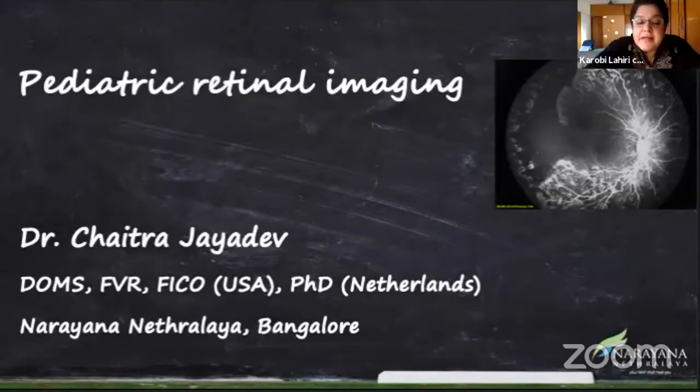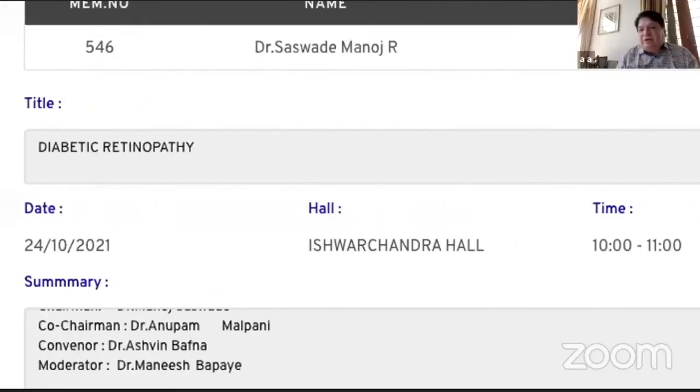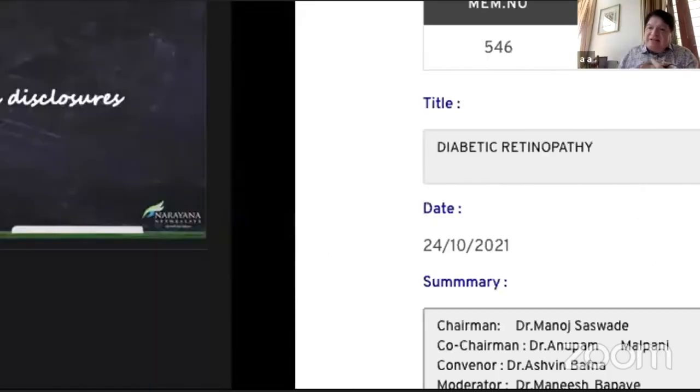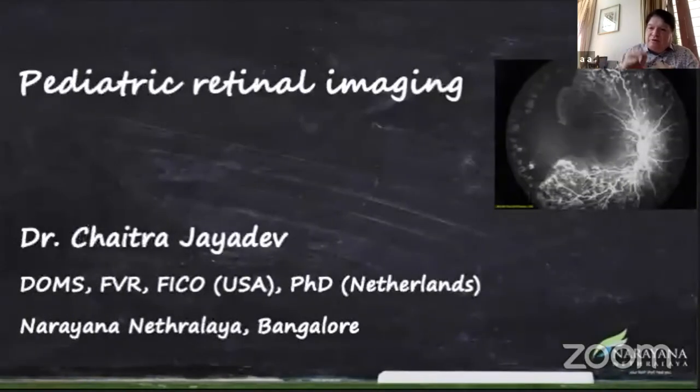But is there any table where you say that if the person has so many decibels over here, he's going to have this much amount of vision, maybe 6/60 or 6/30? No, it's a generalized vision. It's not like one 8 decibel value. Some spots which were -8 became 0, or those which were 2 became 10. So that is the decibel change of that particular spot.